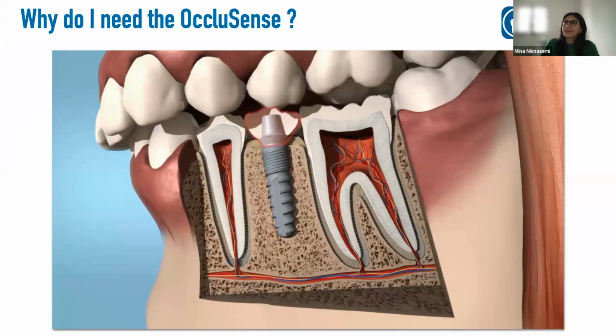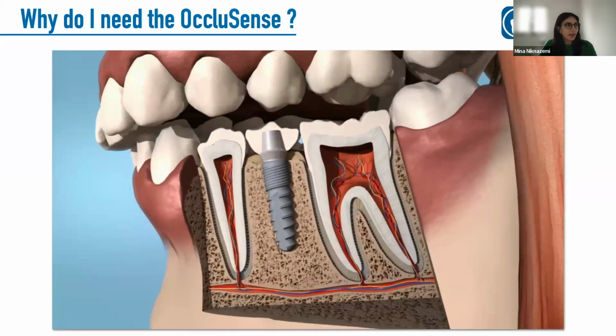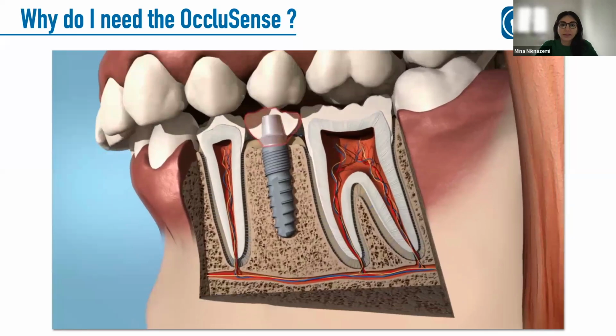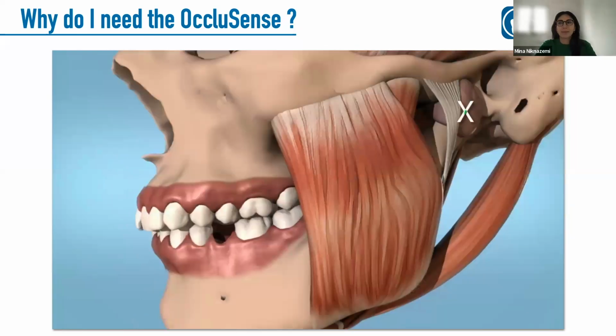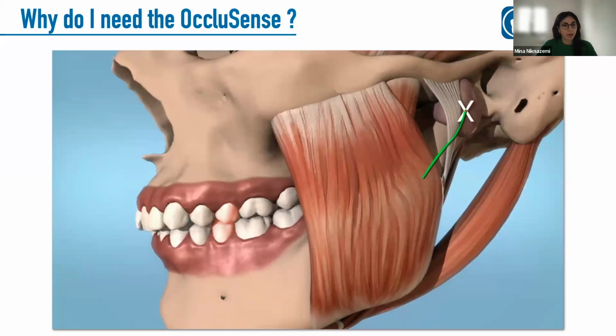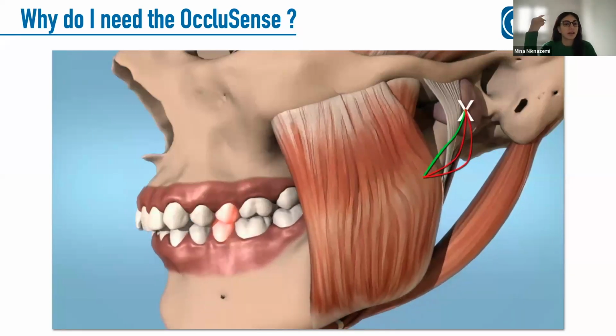But do we really need that much in-depth information for every single treatment? If we take an implant as an example, we know that the threshold for tactile sensitivity of an implanted construction is much higher, about 8 times, than the threshold of vital teeth within their natural periodontium. So any occlusal interferences, as for example, a construction that is slightly too high, won't present themselves on the implant as they would on vital teeth. The symptoms will be different. And any disbalance within the system can lead to functional disorders.